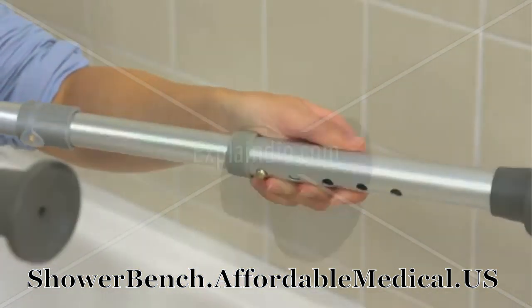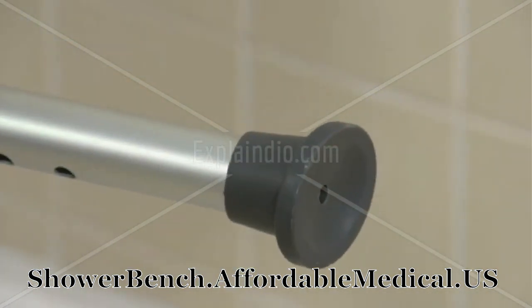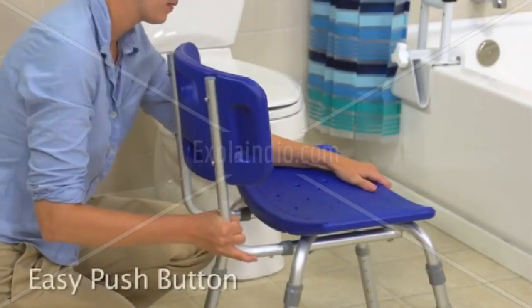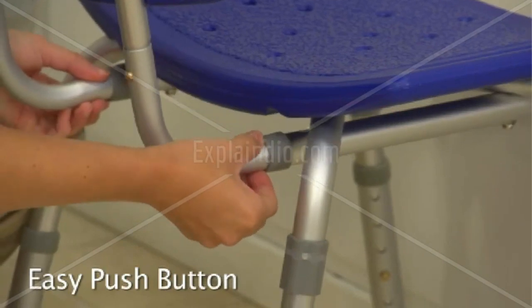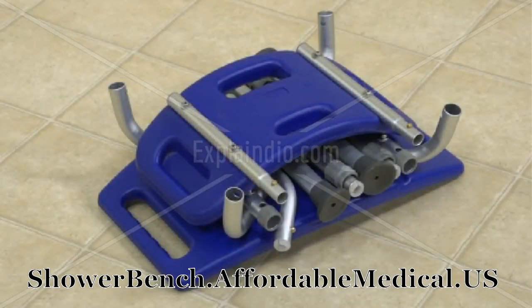High adjustable angle legs with suction cups provide excellent support and stability. The back, seat, and legs all snap together easily, so no tools are required for quick assembly. And it's easy to disassemble for travel.